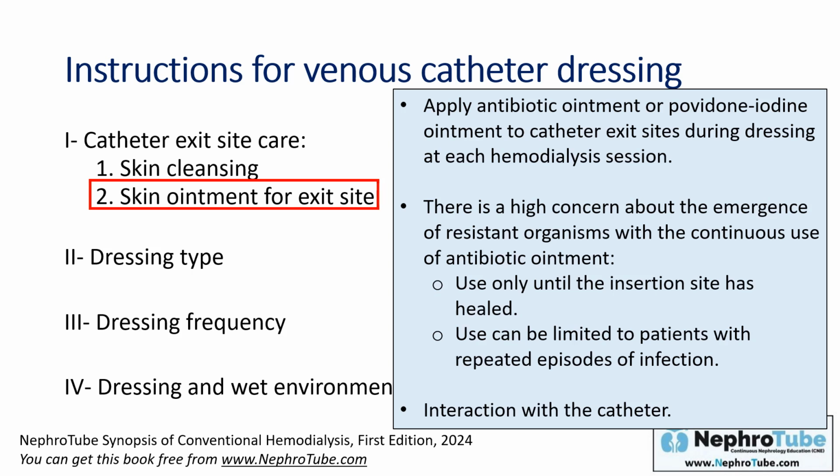An important point to keep in mind is that there may be an interaction between the ingredients in the antibiotic or povidone iodine ointment and the catheter. So please ask the manufacturer you get the catheter from about the possibility of interaction of the catheter material with the ointment you are using.